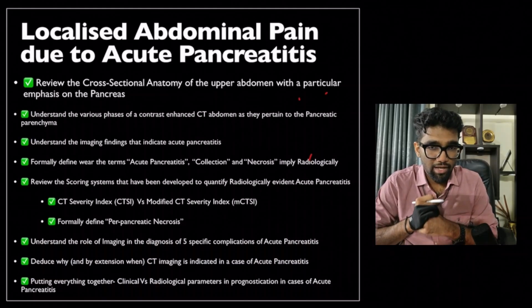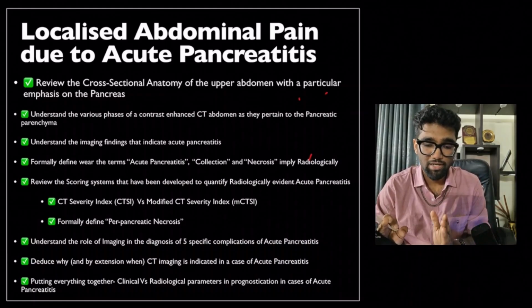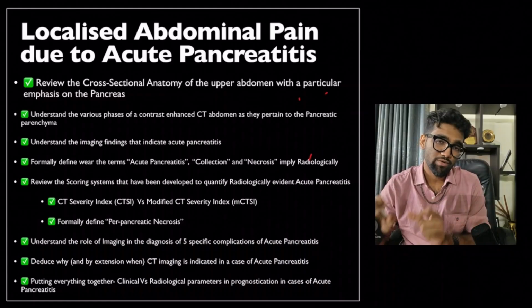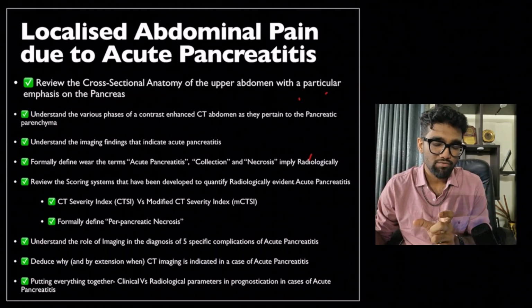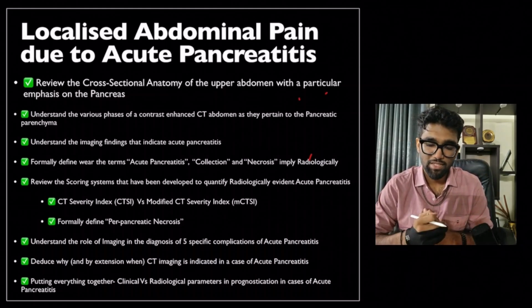But again, an imaging finding that can give you an idea is a CT, but that CT has high specificity, low sensitivity. So only 20 to 25% of those CTs are going to show air within or around the gland. And in that case, you can be reasonably sure that it's an infection. But in every other case, the assessment of whether or not infection is present is clinical.